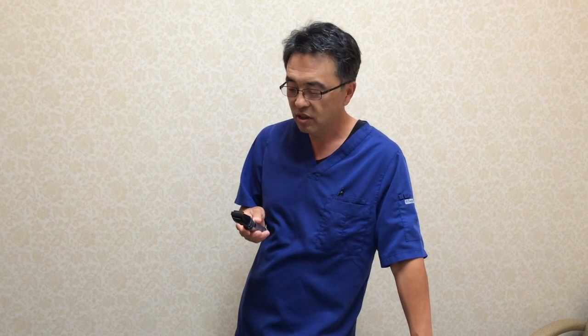Hi, my name is Dr. Chung. This video today is designed to teach you how to do a shortcut in the use of the ophthalmoscopic exam.